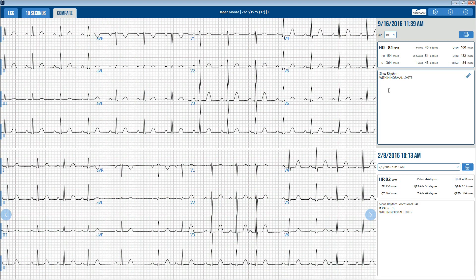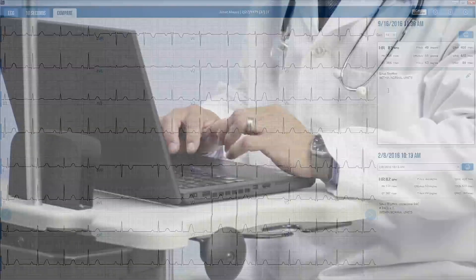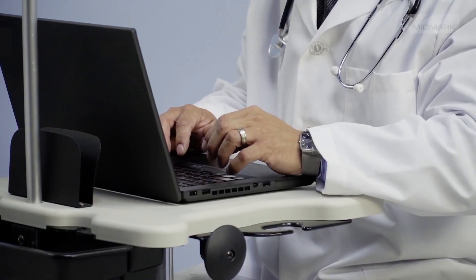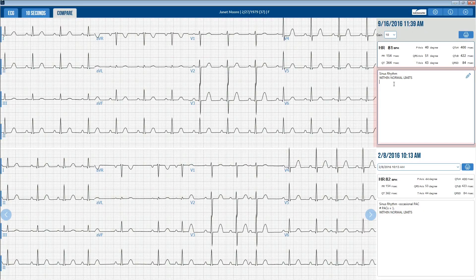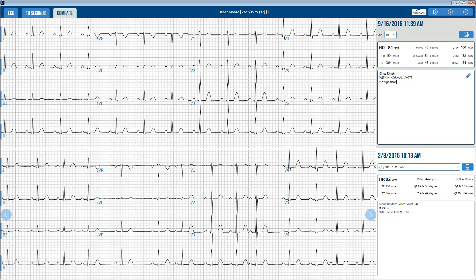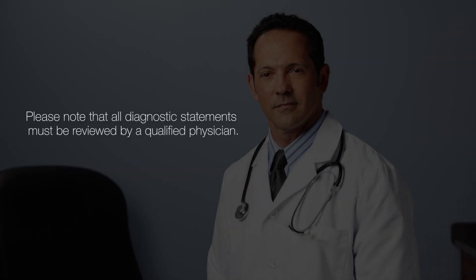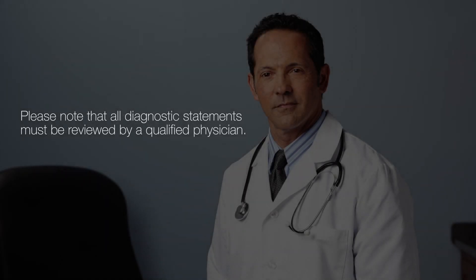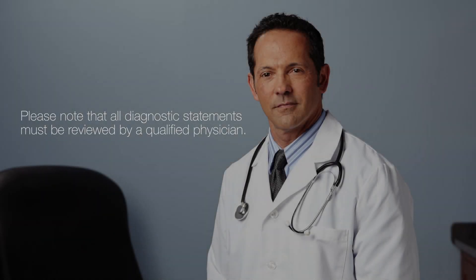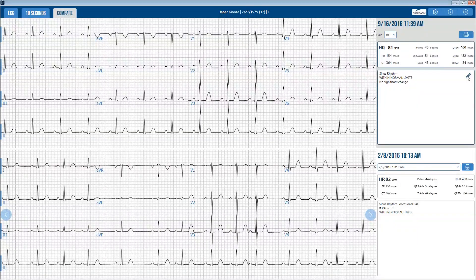If you'd like to make changes to the interpretation, you may edit or enter an interpretation in the interpretation field by using the free text typing capability. Please note that all diagnostic statements must be reviewed by a qualified physician. You may also make changes to the interpretation using customized statements by selecting the pencil icon.